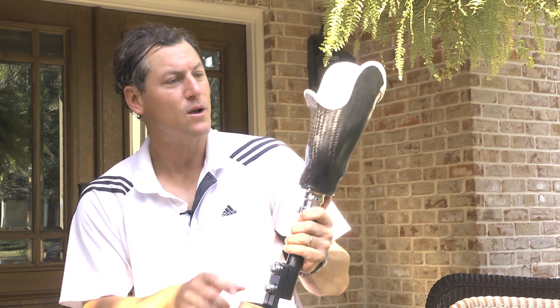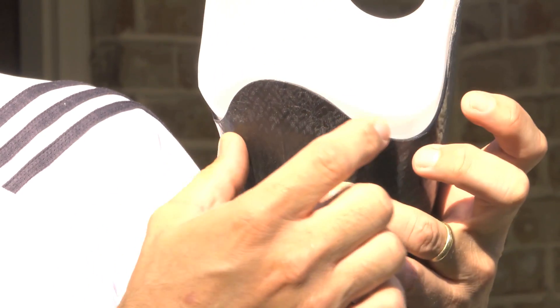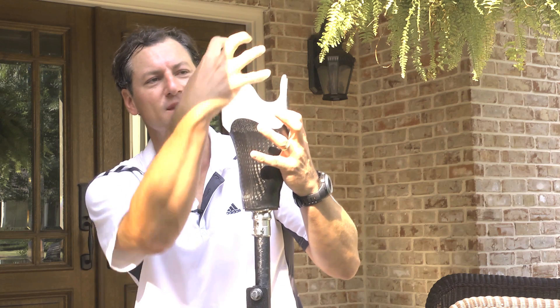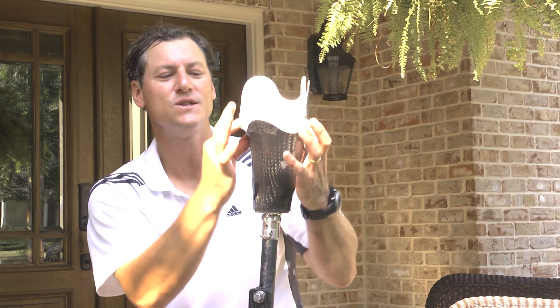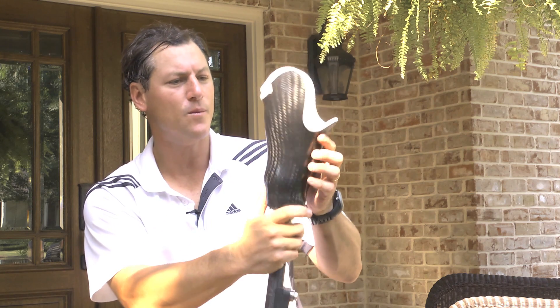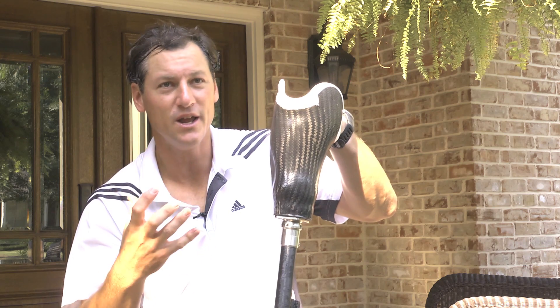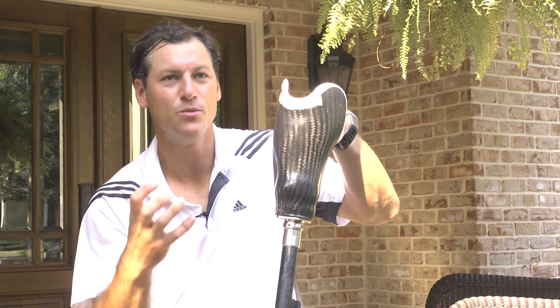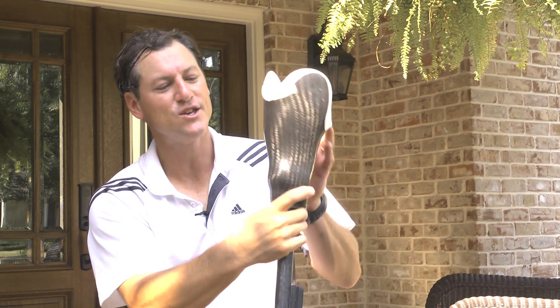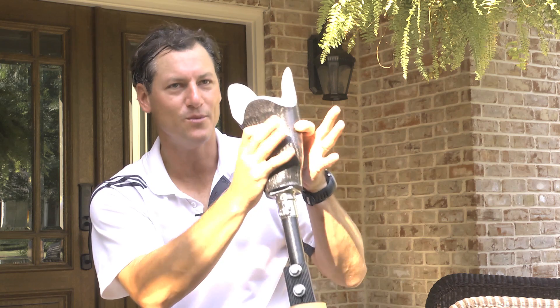Another interesting part of this is that I like to cut the carbon fiber frame a little lower at each of the hamstring tendons, which when I'm in deep knee flexion during cycling gives me a more comfortable socket fit. Since I'm not using this prosthesis for running or activities where comfort is the top priority, we did tighten this socket up — you can see the definition in the socket — to give me a very secure fit and make it feel more like a single unit.